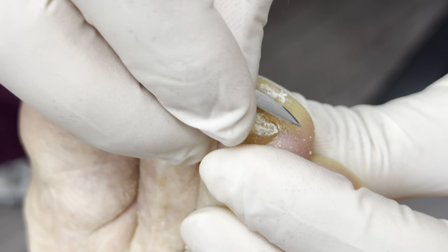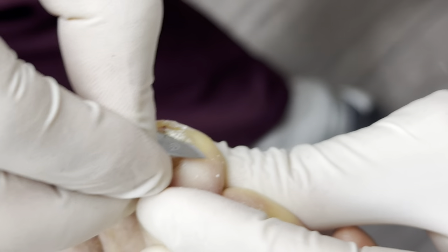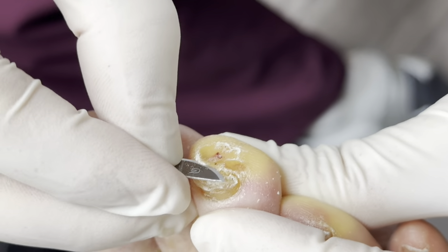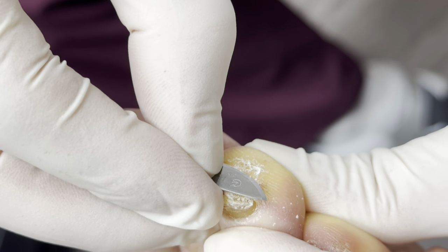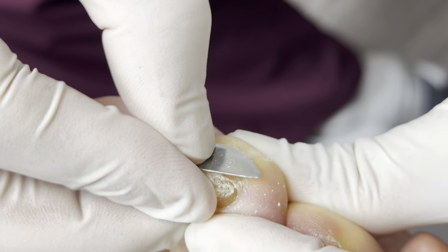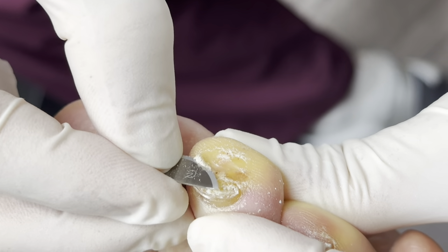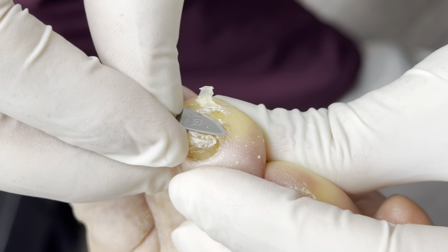We call it minimum incision surgery. When I bought the practice some years ago, the doctor I bought it from was a world-renowned minimum incision surgeon, and he taught me how to do these very, very great surgeries — without too much time off for the patient and really quick recovery.